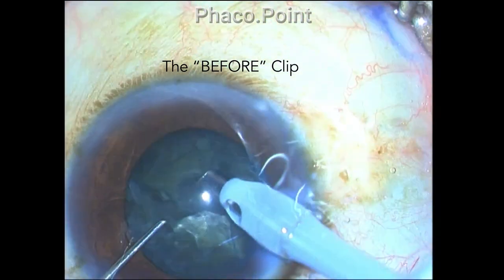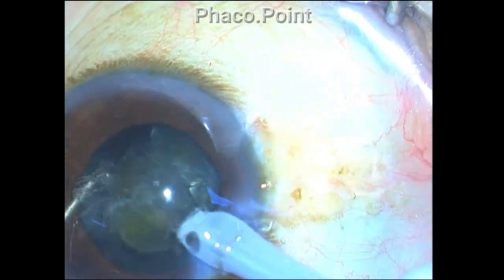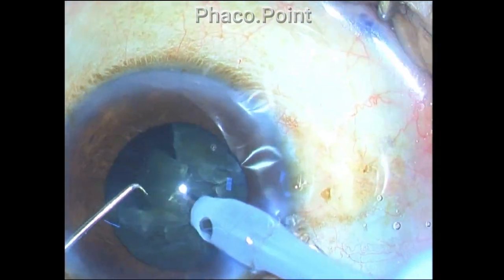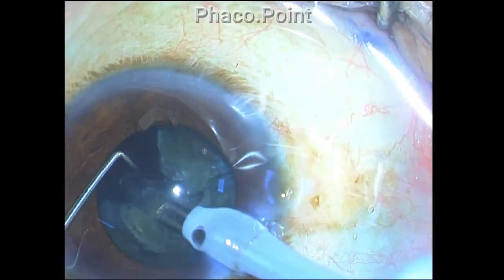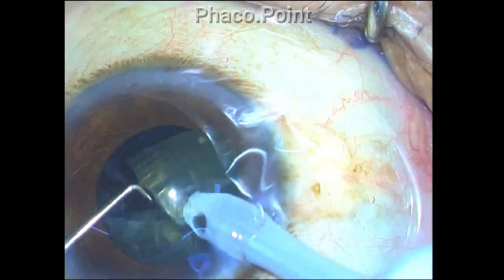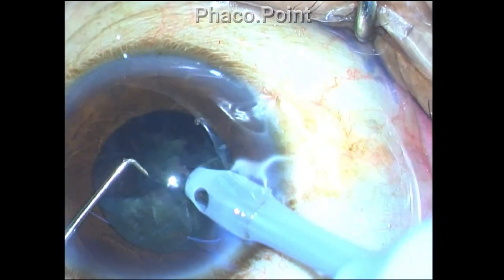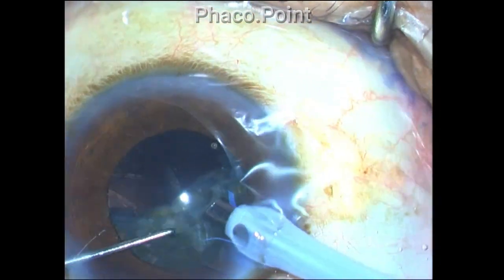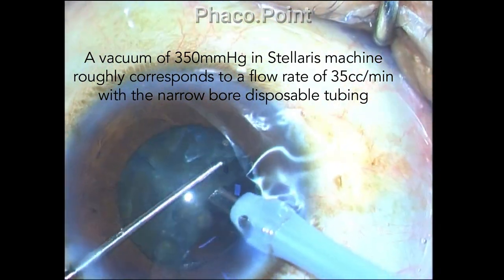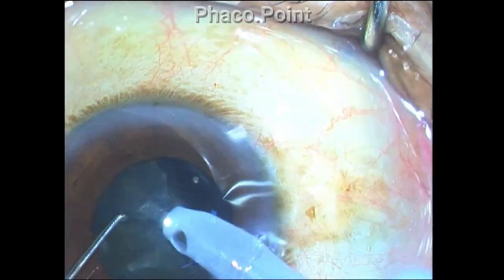As you watch this video clip, you must be wondering that the followability in this particular case is not too exciting or too impressive. There are certain mistakes that you can see. The surgeon is excessively moving the phaco tip back and forth. The surgeon also attempts to run after the fragments instead of allowing the fragments to come towards him into the phaco tip. The followability in this case, where the vacuum is set at 350 millimeters of mercury in a venturi machine, is okay but not very good.